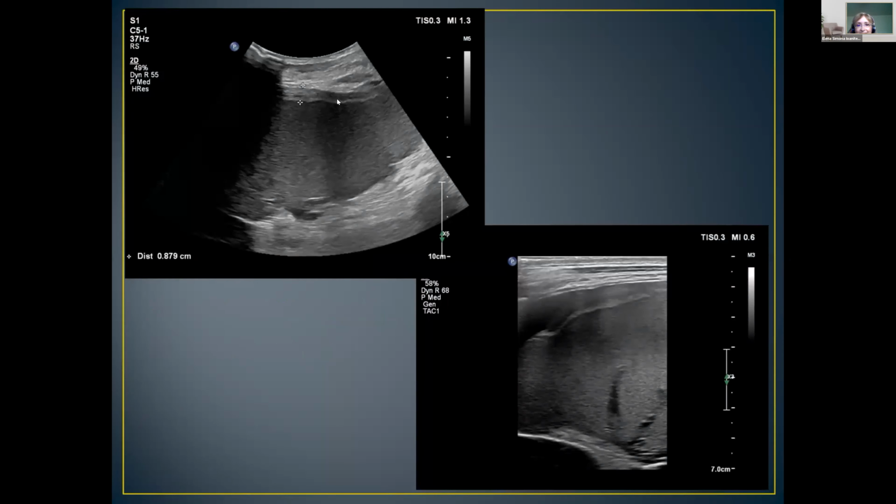Yes. You can really see how the hematoma is compressing the normal splenic parenchyma. This is why I said subcapsular, because if you have the hematoma outside, you shouldn't see the parenchyma of the spleen, that it's with an irregular surface.